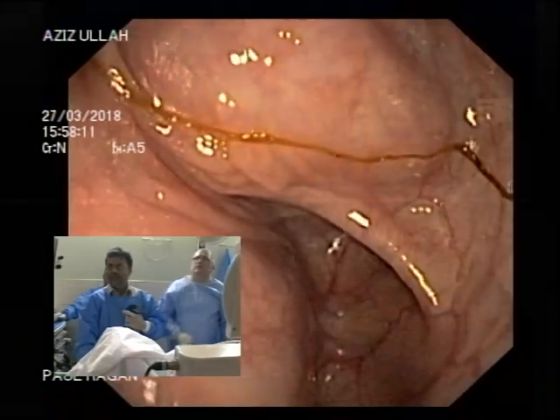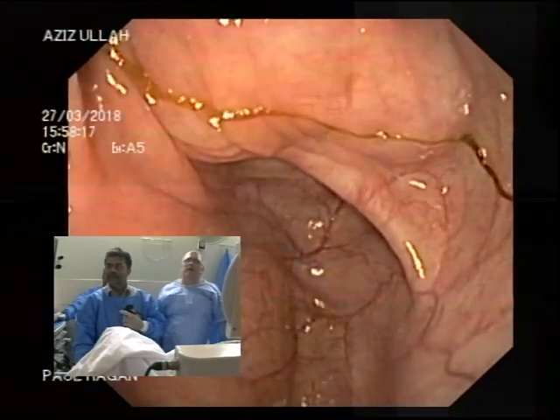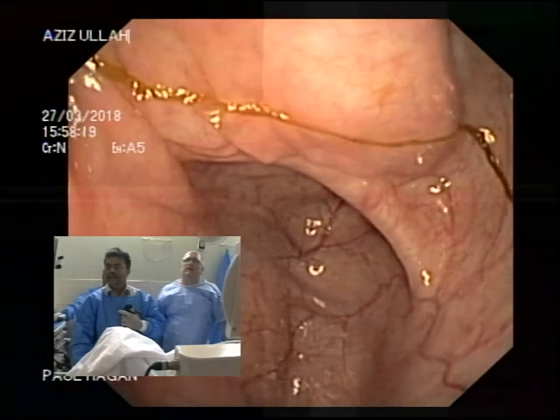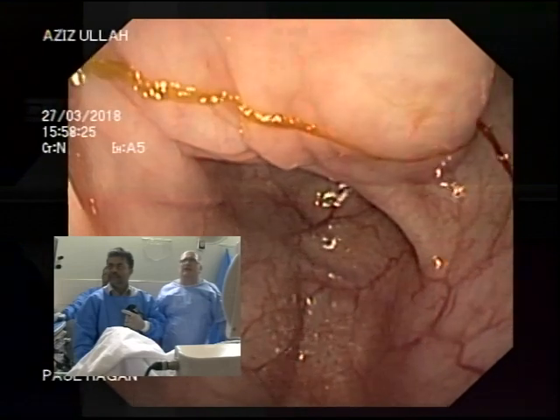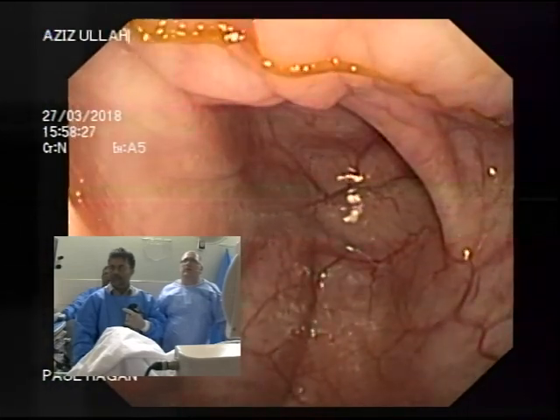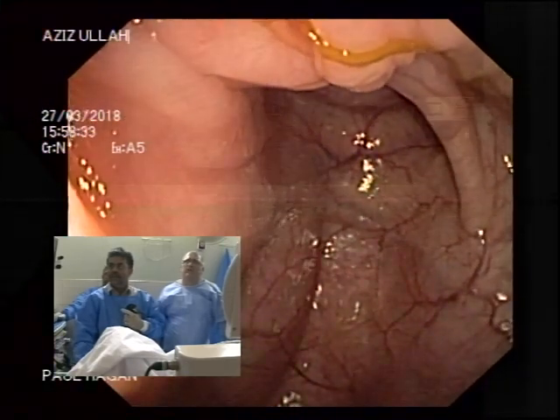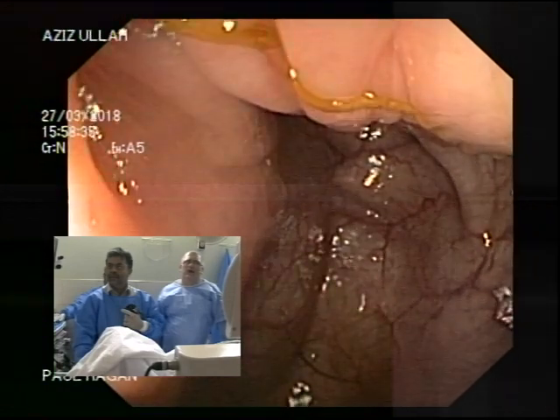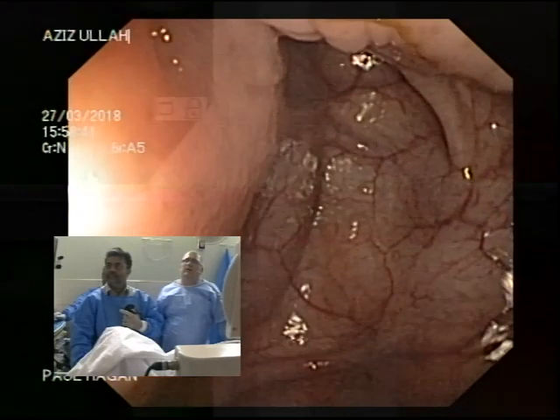Good. Slowly, not too much. Too much torque. Take the torque off. That's it. Draw back. Keep drawing back. Nice and slow. Don't get pressured by the fact that I say keep drawing back. Okay. Keep coming back. Nice and slow. Well done. Brilliant. Keep coming back.